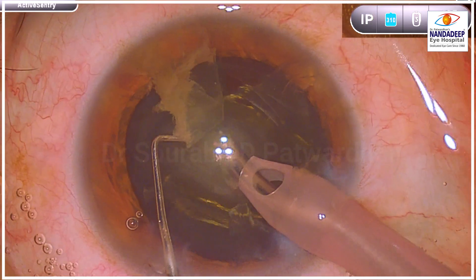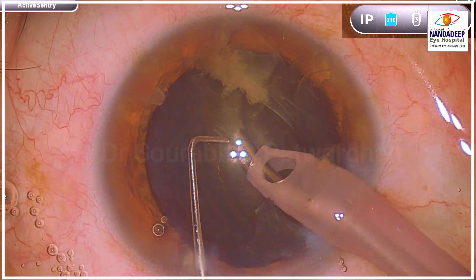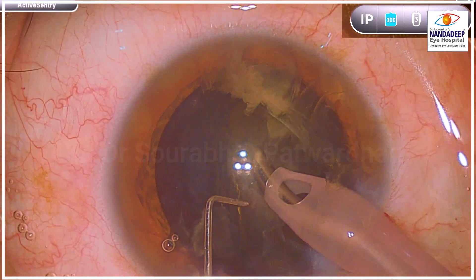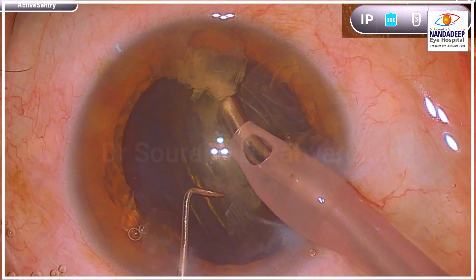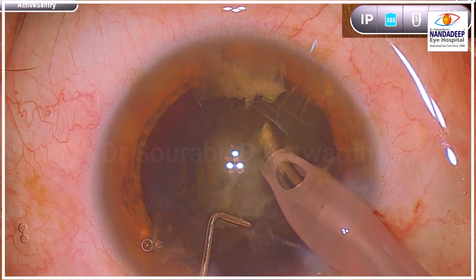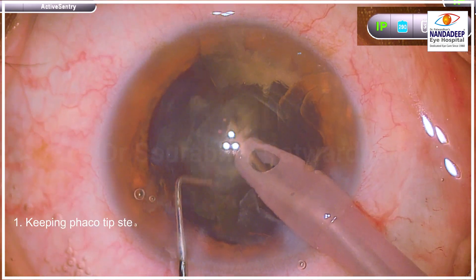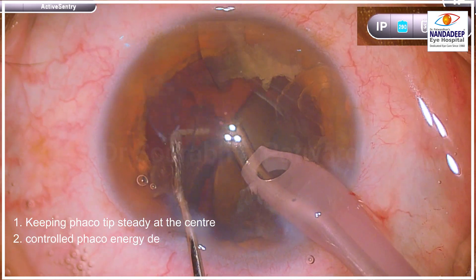I start emulsifying from the periphery towards the center. As the piece becomes smaller and smaller, it becomes easier to emulsify it further. I am not attempting to chop this piece and I am going to emulsify it completely without any chopping maneuver. That makes it much easier to do and also much quicker. You will find that I am attacking the substance of the nucleus very efficiently.